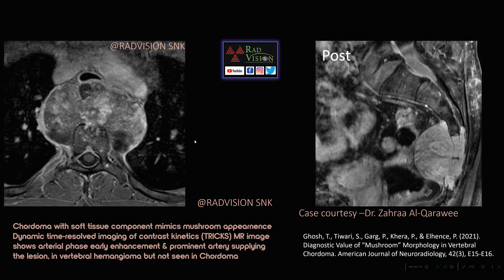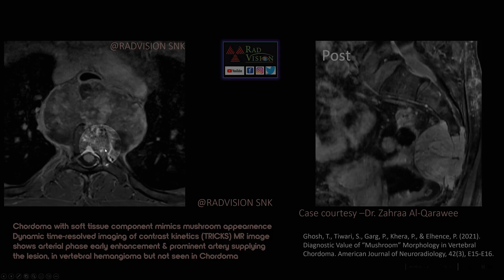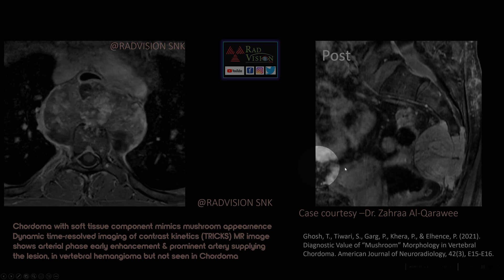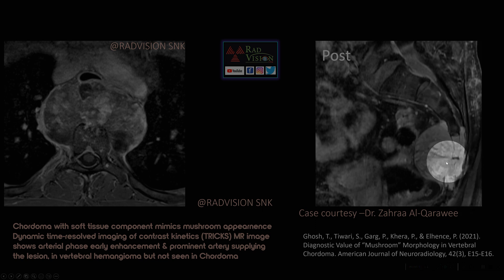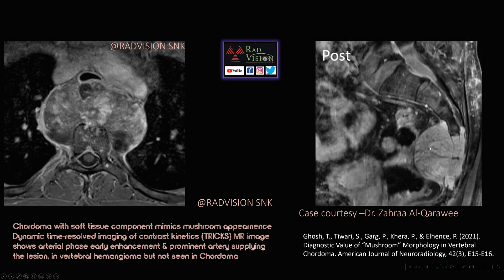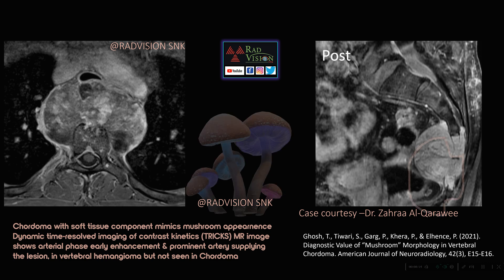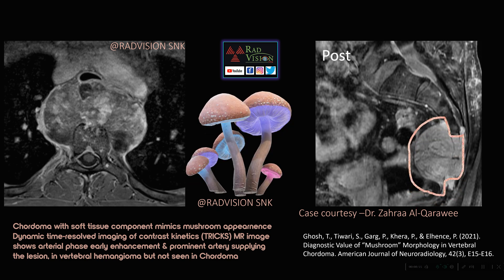Next, this was a case of chordoma arising from the vertebra with a significant soft tissue component. Here is another case of chordoma in the coccyx, showing intense homogeneous enhancement with significant soft tissue component extending into the presacral space. This mimics a mushroom. Whenever you see a chordoma with this mushroom-type appearance, suspect chordoma.